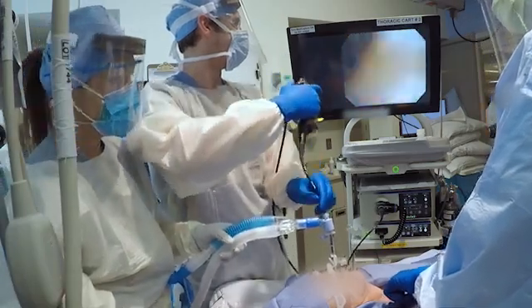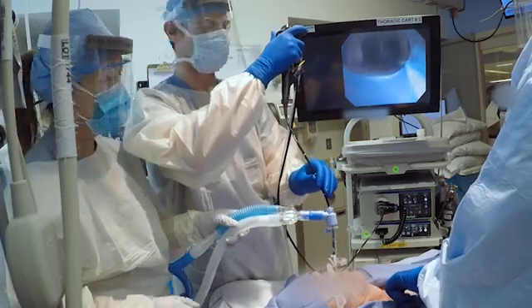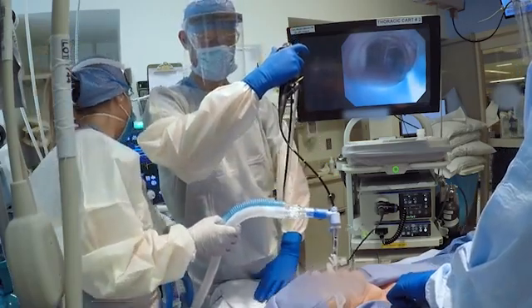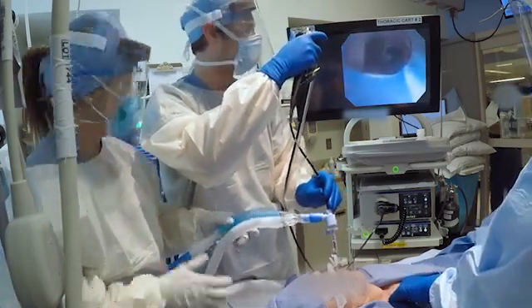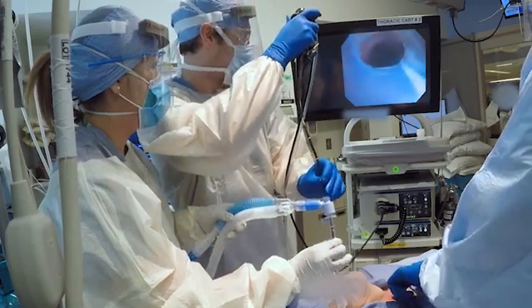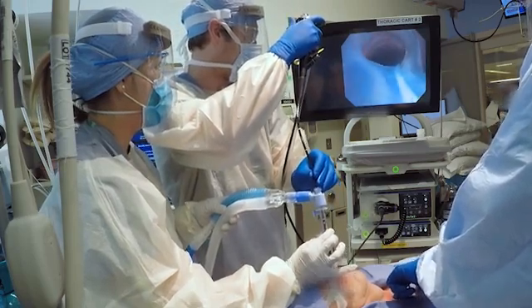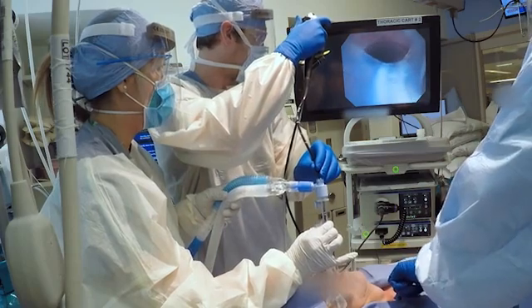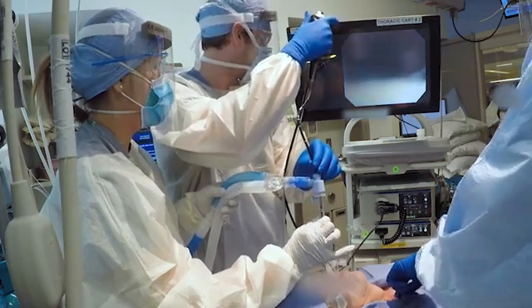Once all team members are ready, advance the bronchoscope into the oral endotracheal tube until the camera is aligned with the end of the tube. At that point, the respiratory therapist should again induce apnea. The respiratory therapist deflates the oral endotracheal tube cuff. The respiratory therapist and the bronchoscopist together then slowly withdraw the oral endotracheal tube and bronchoscope simultaneously until the subglottic landmarks are visible. Palpation of the anterior trachea by the surgeon can facilitate identification of these landmarks. The bronchoscope is kept within the oral endotracheal tube at all times to ensure control of the airway. Precise communication and coordinated movements between the respiratory therapist and bronchoscopist are crucial to prevent accidental extubation.